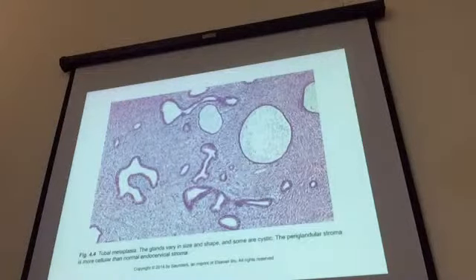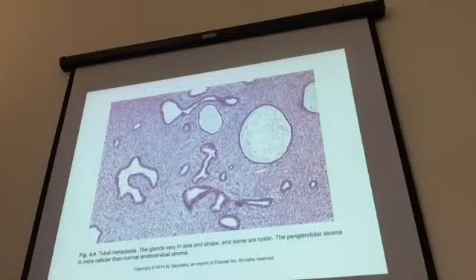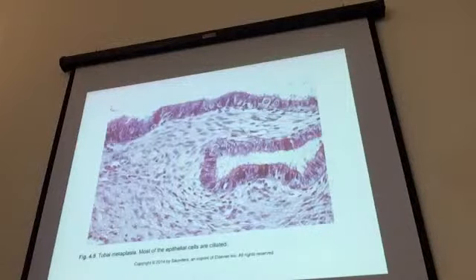So here's an example. You see small, medium-sized glands and a slightly darker columnar lining. Maybe a little stratified here and there, and some irregular shapes. So sometimes this can raise concern for adenocarcinoma in situ. And at higher magnification, we see that some of these nuclei are quite big, the chromatin is a little coarse, and they tend to pile up a little bit. So they look different than normal endocervix.